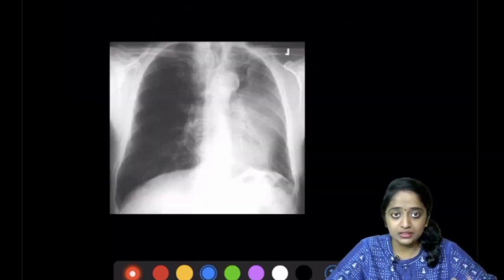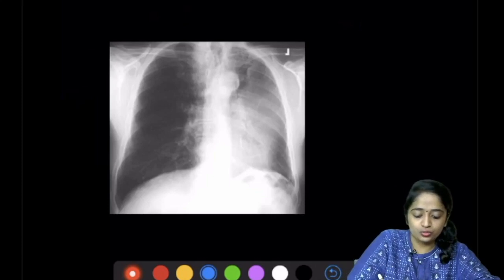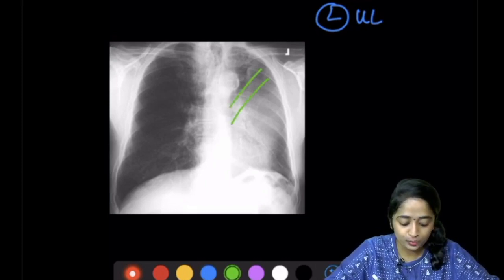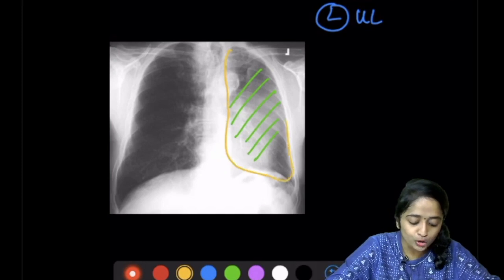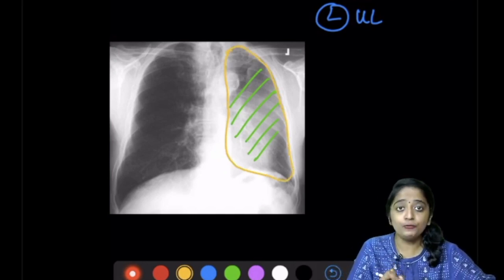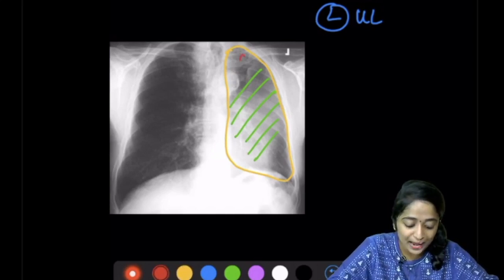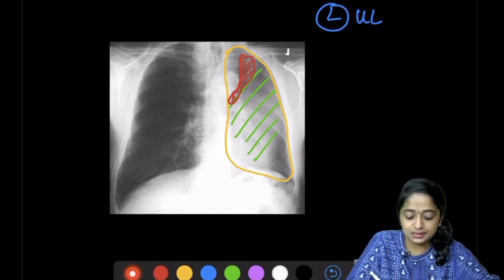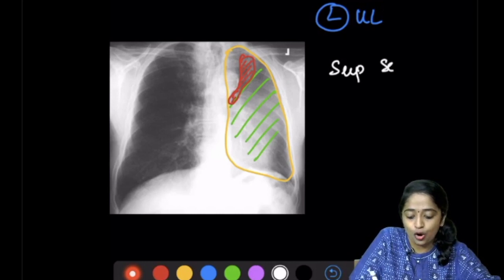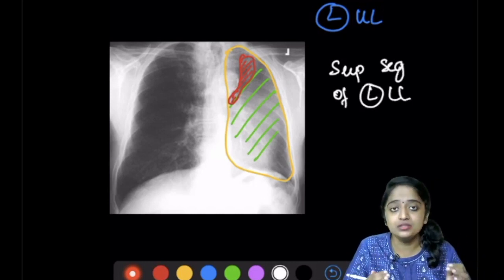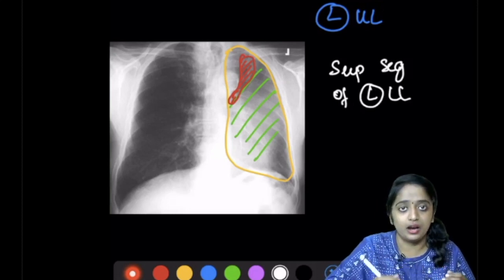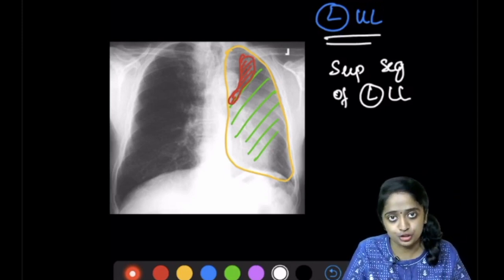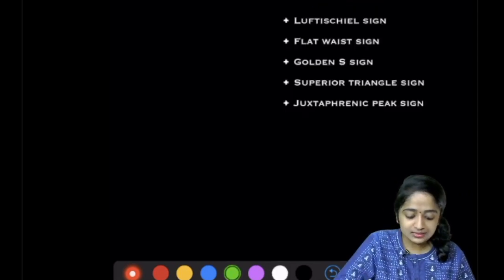This chest X-ray demonstrates classic left upper lobe collapse — there is loss of aeration seen as opacity, and there is definite volume loss. If you look carefully, you can see a band of lucency surrounding the aortic knuckle. This represents the spared superior segment of the left lower lobe undergoing compensatory over-inflation, outlining the aorta. This is the classic Luftsichel sign in left upper lobe collapse.